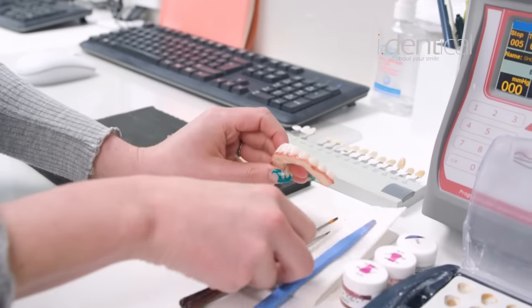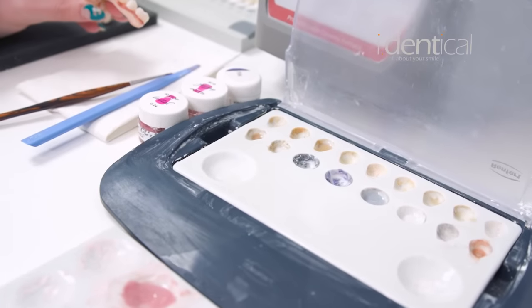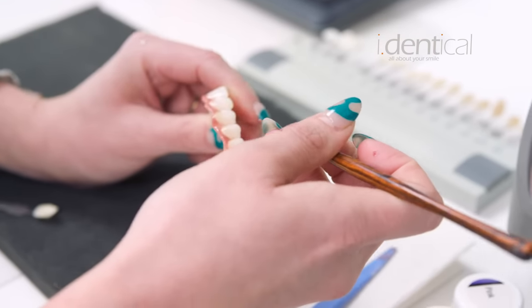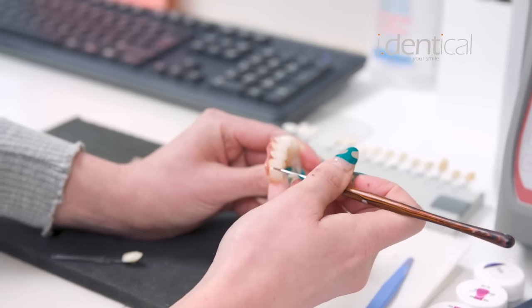I'm going to start by adding some paint here to give it a sheen so that it looks like a natural tooth rather than what we have on this side. I'm just going to add a little bit to the gum line here first. After I've added it to the gum line, I'm going to pull it through the tooth so that we have that shade going all the way through.